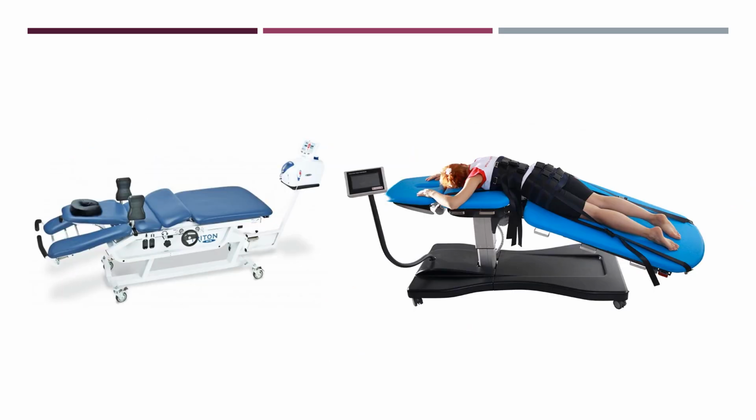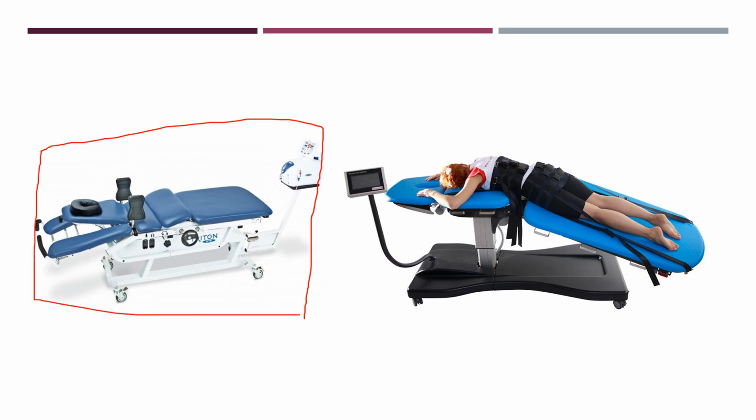Here are some other different types of traction units. These ones are a little bit nicer than the ones that we have in our lab. But you can see this one over here. This is really common in the clinic. It has a nice little armrest, it has the face plate for your patient, and it also has these nice little stabilizing bars on the side, which is just going to provide better stabilization, better traction in the long run. And you can see that these tables move all over the place. So this would place your patient's hips in a little bit more flexion, trying to target something like, again, maybe the middle or the upper lumbar spine.